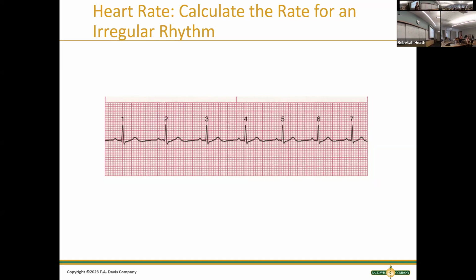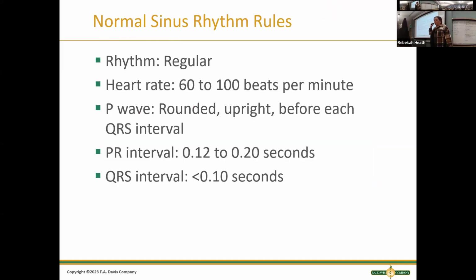Oh, I forgot to say, irregular rhythm, both regular and irregular, you just count the QRS complexes. Oh, this wants me to talk about normal sinus. Okay, let's talk about normal sinus rhythm really quick.